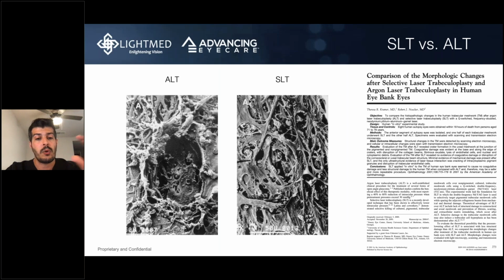And theoretically, if you're not holding the lens properly, you can scratch the cornea. That would definitely be painful. But as long as you have enough gonio lens gel, as long as the eye is numb, I don't expect any pain or discomfort. But we still obviously write it in our consent form because discomfort means different things to different people. Some patients sit at a slit lamp and the neck position is not comfortable to them, and they call that discomfort. So then you have to ask, what is it that they mean by that?